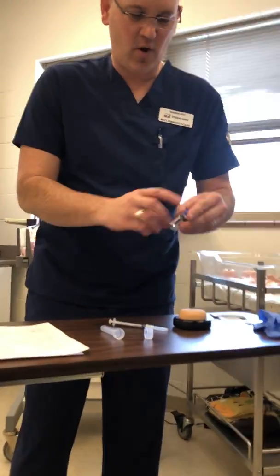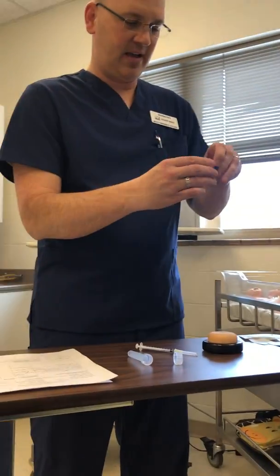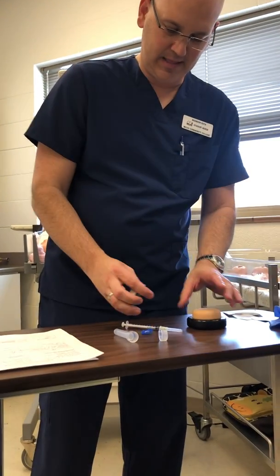First thing we're going to do though is check for any cracks on our vial, and if it were a mixed medication to inject, we would roll it through our hands, twist it around, and just gently mix it together. We would then pop the lid off.